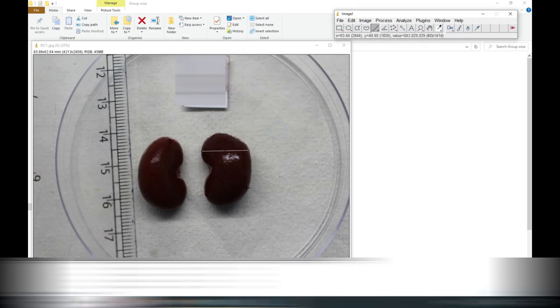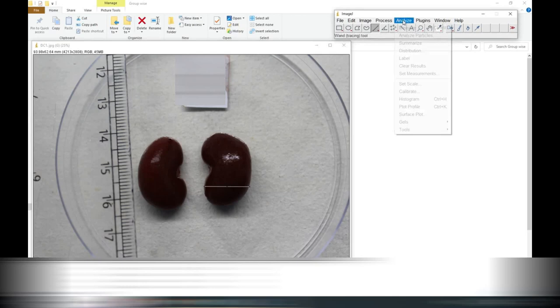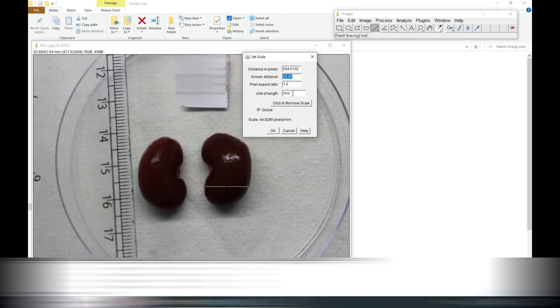Three measurements we have taken for width. Make average of these three and take the reading for the width.